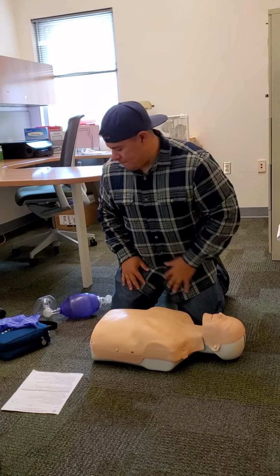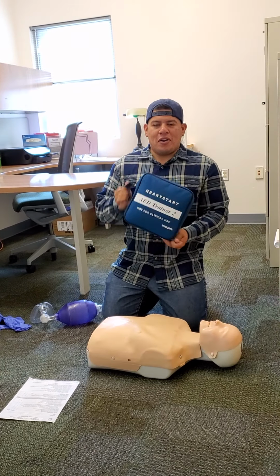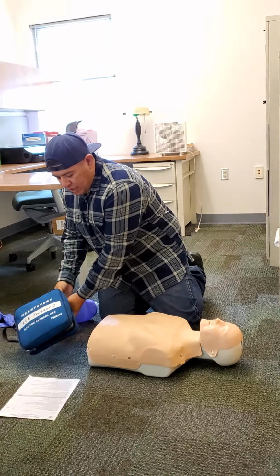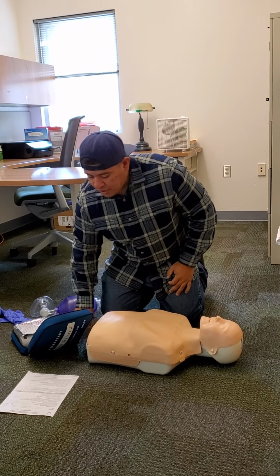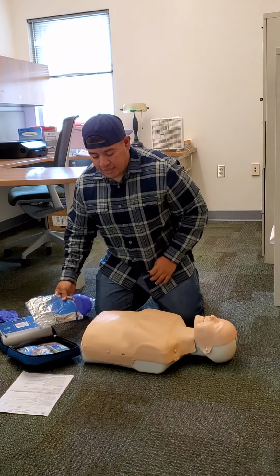Okay, so go ahead and bring your AED. So at this point, your partner will bring you your AED. And you will turn on your AED and follow its prompts, so it'll give you directions on exactly how to use it.